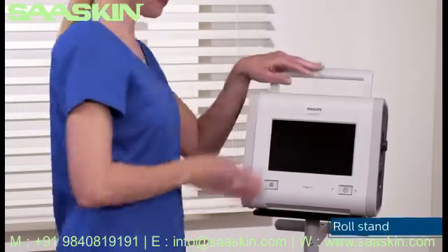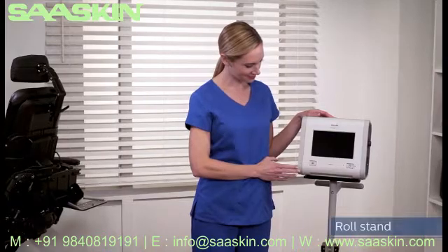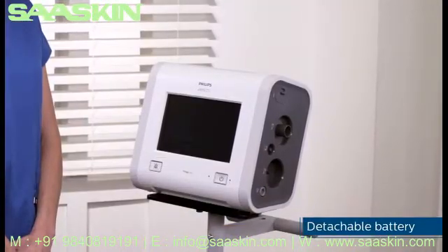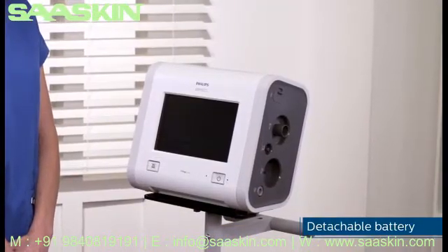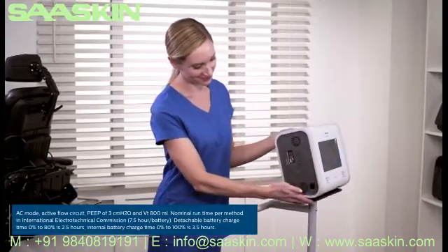For optimal performance, use only accessories intended for use with this device, such as the roll stand. The detachable battery can provide up to 7.5 hours of therapy and, when combined with the internal battery, can increase to 15 hours.